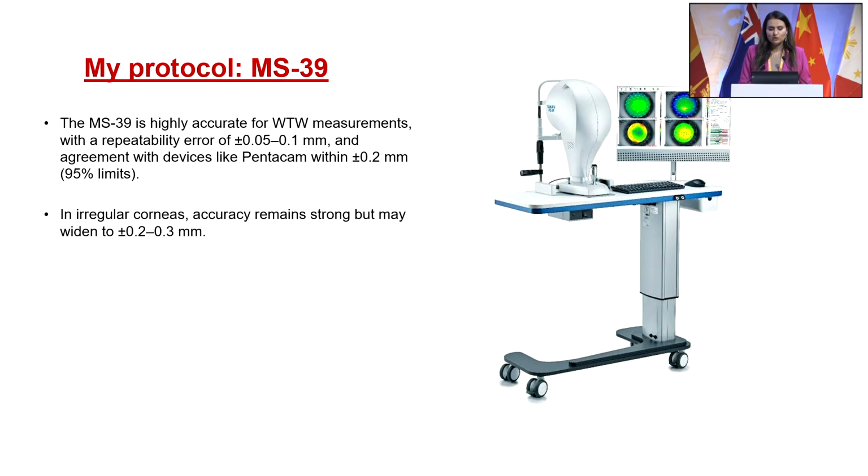So my protocol briefly, I'm using now MS39, because MS39 is highly accurate for white to white measurements with a repeatability error of only 0.05 millimeters. And it agrees very well with the devices like Pentacam, which most of the surgeons are now using.